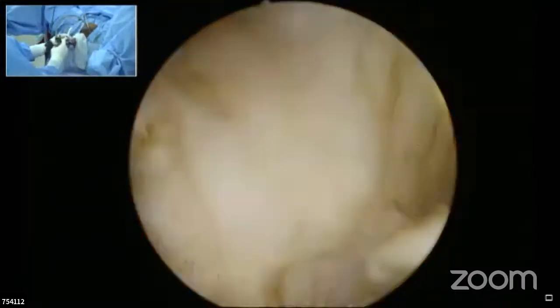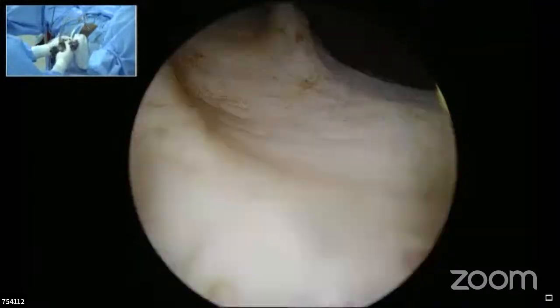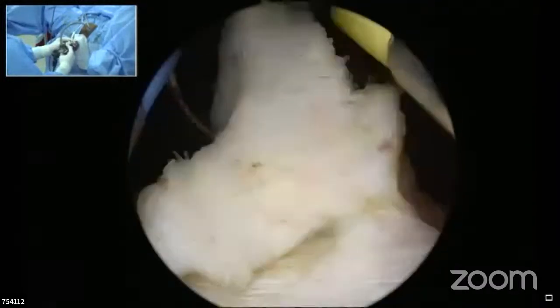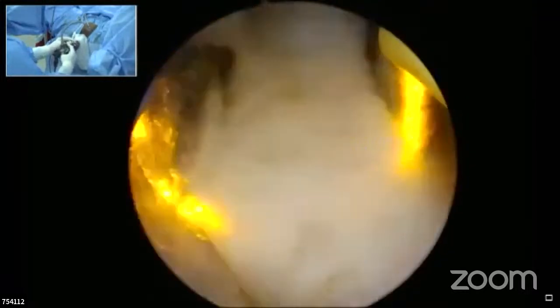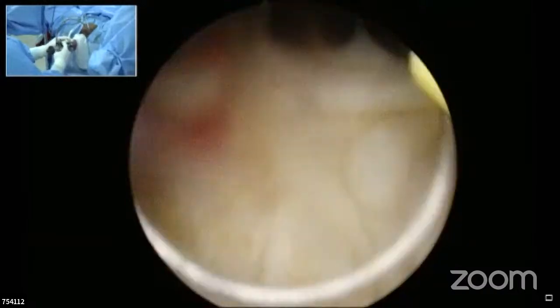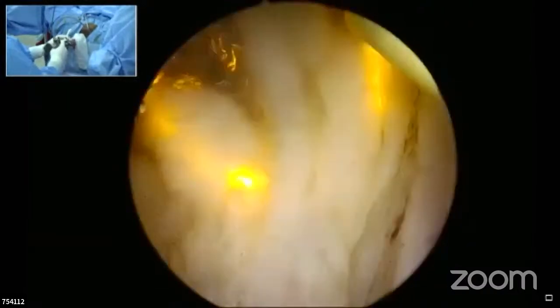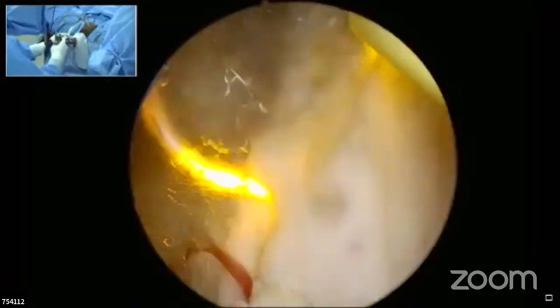So now we are slowly approaching the bladder neck fibers. We go back, reassess. We might be having some amount of tissue further left here, which we can resect back safely at the later part of the stage, rather than risking a subtrigonation at this point.